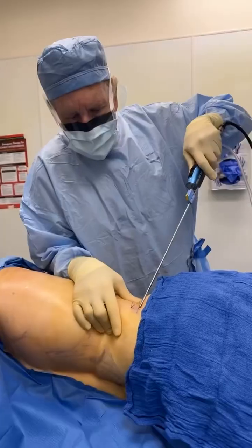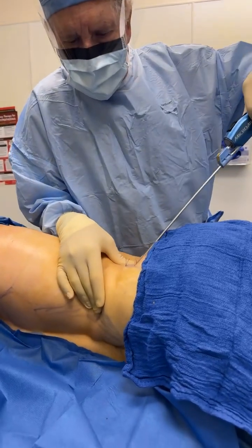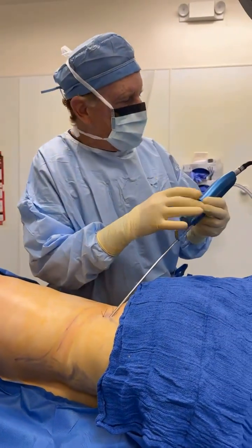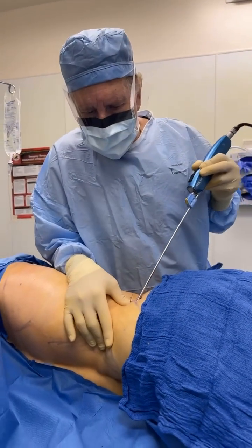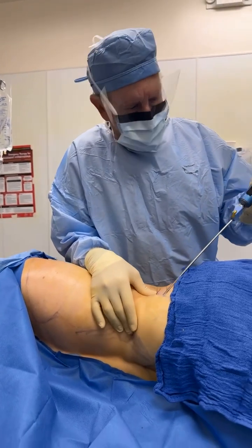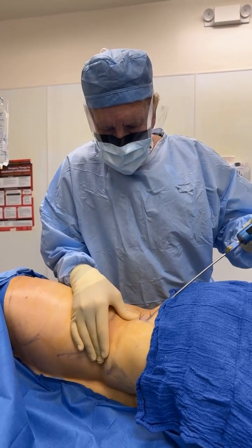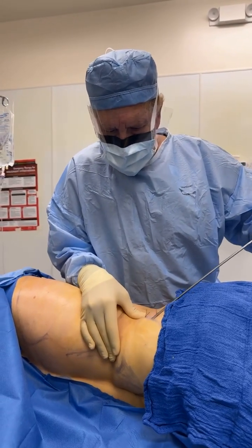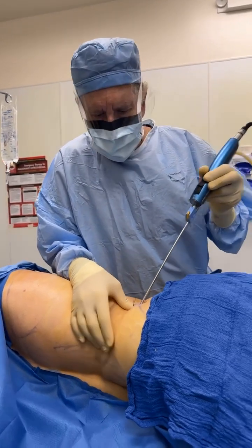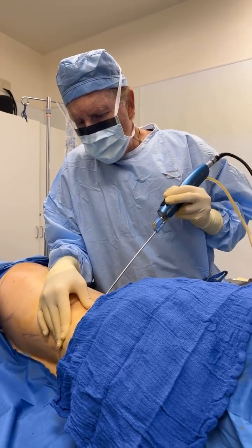Thank you. Good morning, Dr. Patino here at the Cosmetic Surgical Center of Costa Rica. We're going to do micro air power assisted liposuction. Notice that I'm using my non-dominant hand, right? And even like that, because we go slow, we can do that, and there is absolutely no bleeding because we go slow. So it's safe to do this. You can even do it with your non-dominant hand, even if you're not ambidextrous, right?